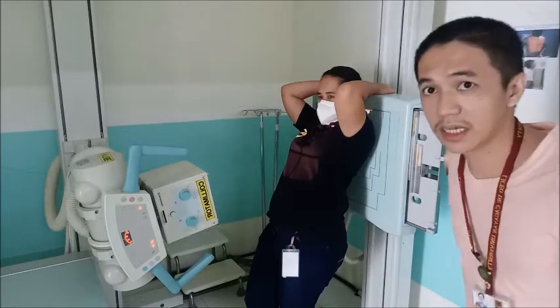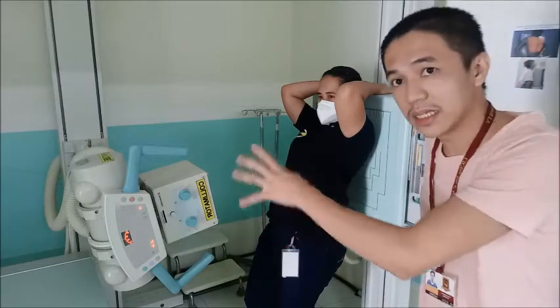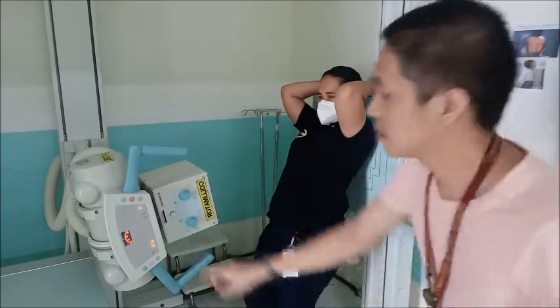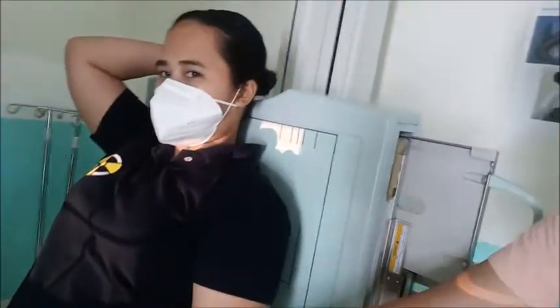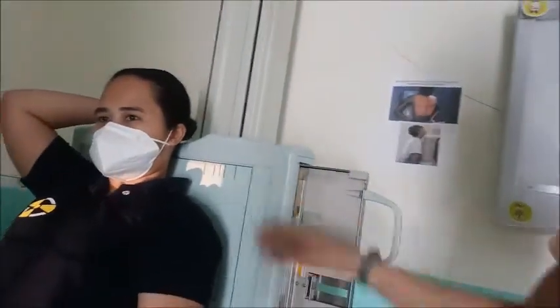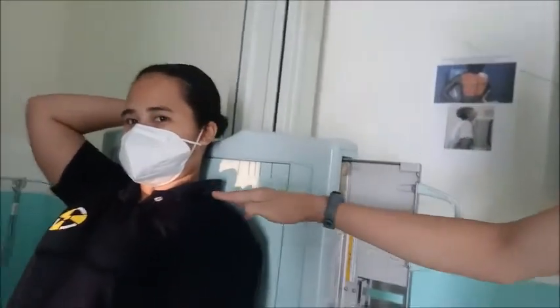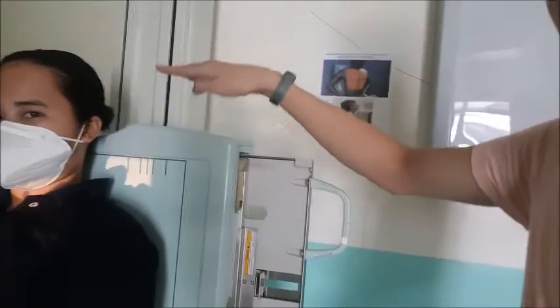Take note, wala gi-adjust ang collimation, wala gi-adjust ang distance, ato lang gi-adjust ang angulation. So kabantay mo sa iyahang collimation, naragihapon sa top of the IR.